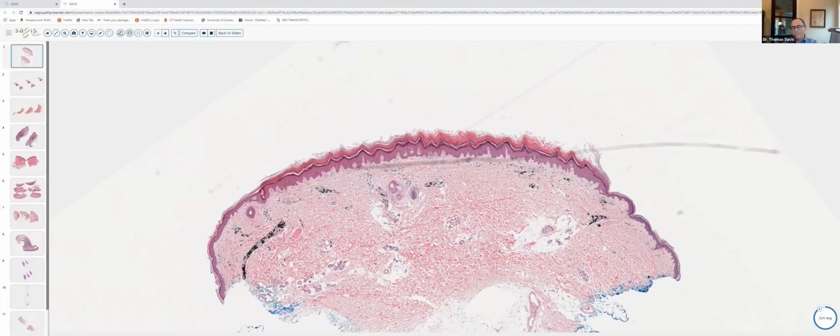Okay, and with slide 4, let me tilt the slide here. Again, inked specimen. So we've got a little excisional biopsy specimen here. And this is clearly from sun-hammered skin. This particular biopsy was from the shoulder right up by the neck. And one can see, and I'm going to use my pen here, this broad solar elastotic band within the dermis here.